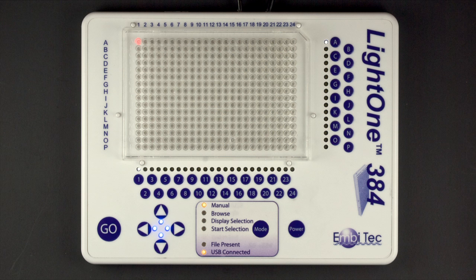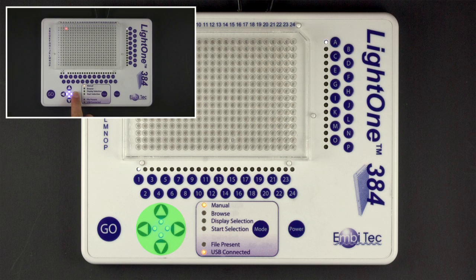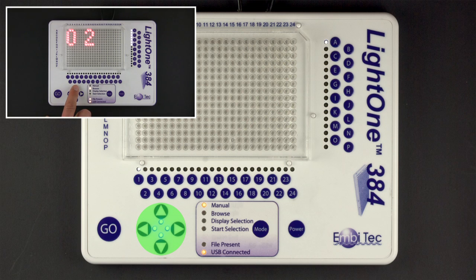The first control you will need to use on the LightOne is the power button located at the bottom right. The power button turns the device on and off and toggles through three brightness levels. The directional arrow buttons are used to control the position of the selection in manual mode, and to browse through templates in USB mode.